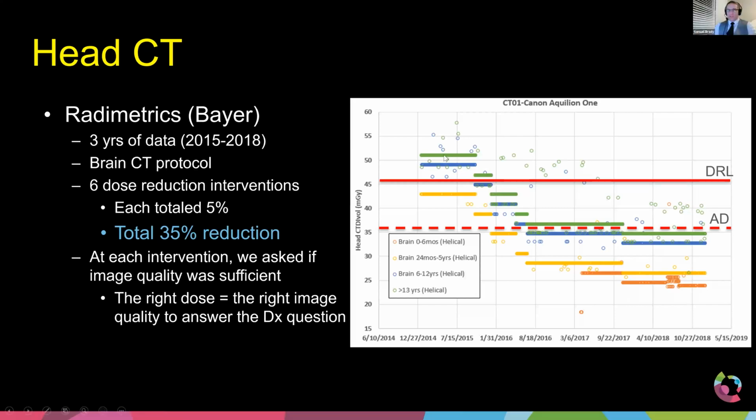Yep, that's a great point. When you look at this, the kV is basically set for image quality and contrast, so good gray-white differentiation and penetration. Just like you said, under 2 you're at 100 kV, over 2 you're at 120 kV. It's a rule of thumb. But to go from this step right here, this CTDI value, down to this one and to this one, because we used fixed mA, all we had to do is just turn our mA knob down.